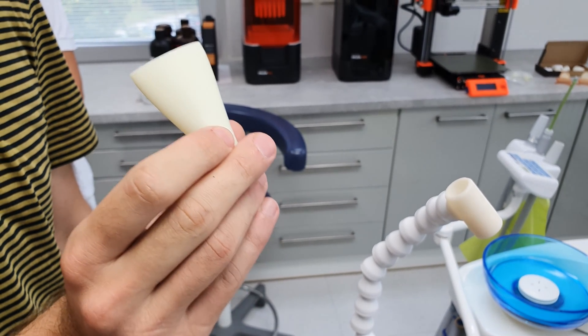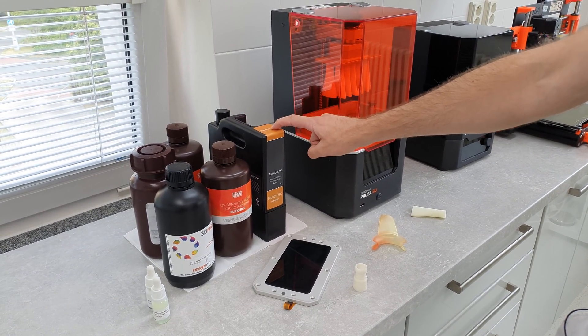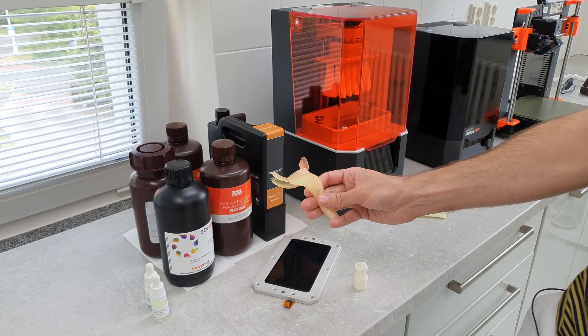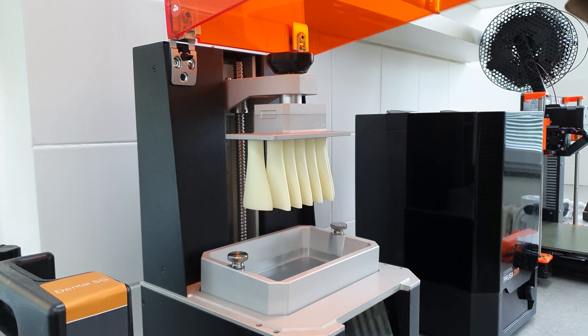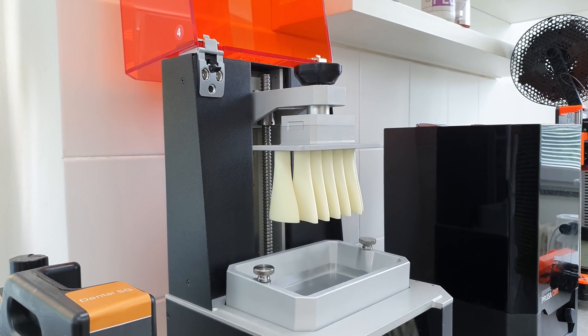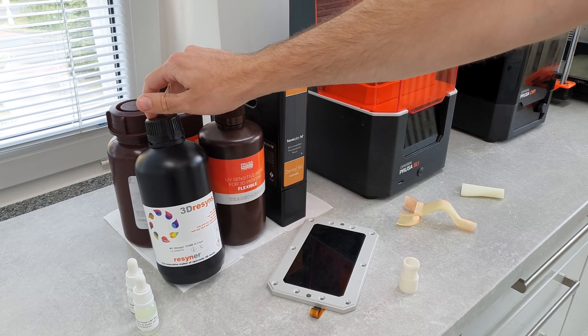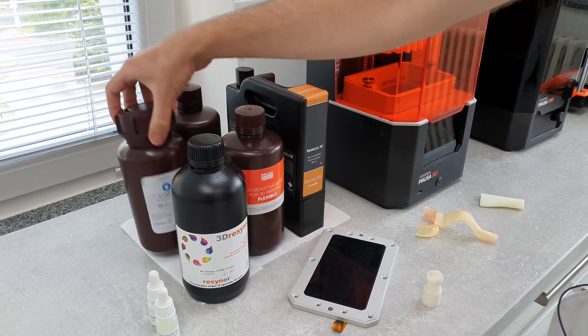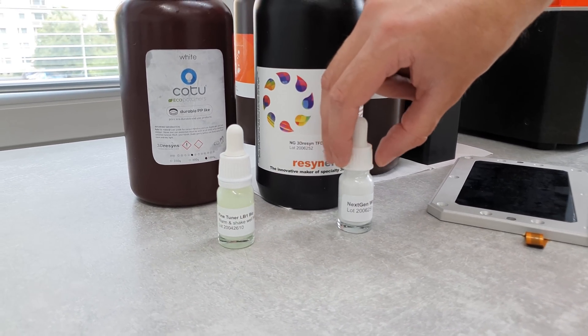Also, these materials are certified to be used in a patient's mouth. We use Formlabs Dental SG, which is a very tough biocompatible material. When used in the original Prusa SL1, the resulting objects are very smooth with minimal tendency to collect foreign matters on their surface. We also use 3D resins and KOTU, because these resins can be mixed with additives, such as colors or accelerators.